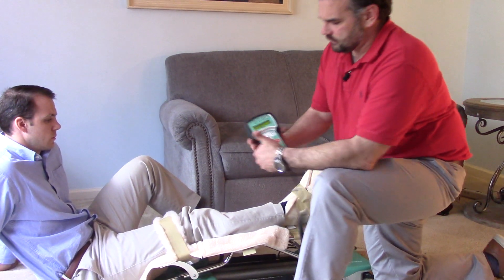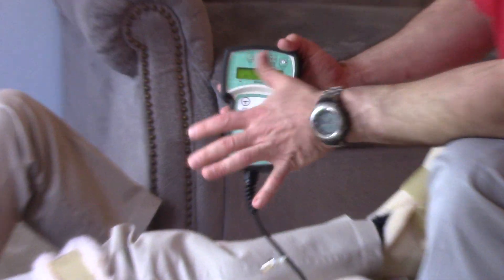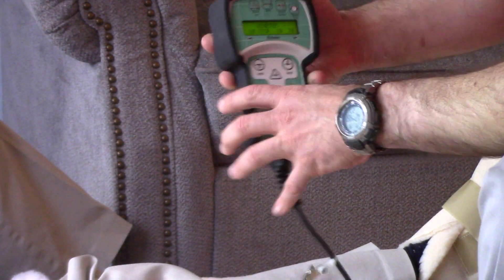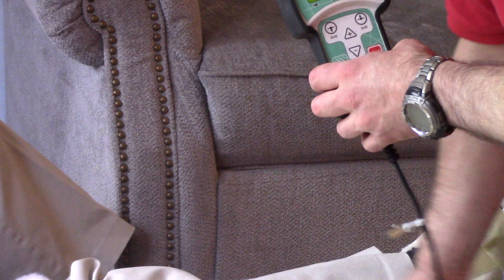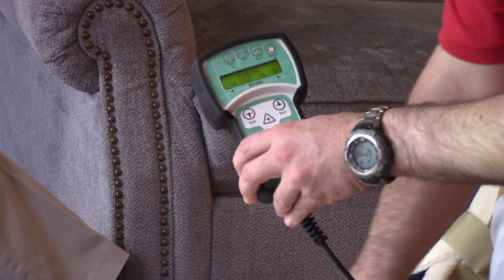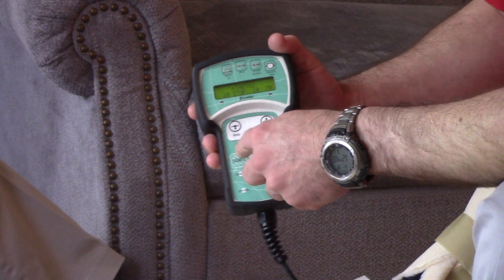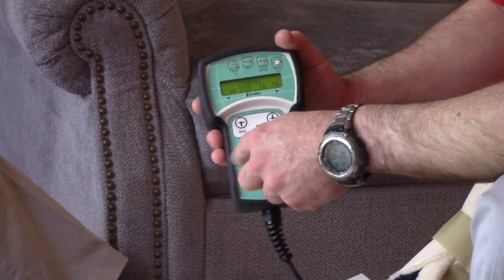So here's your remote. This pretty much controls everything. Once you have the frame set up to your height, that should not have to move anymore. It's basically start and stop.